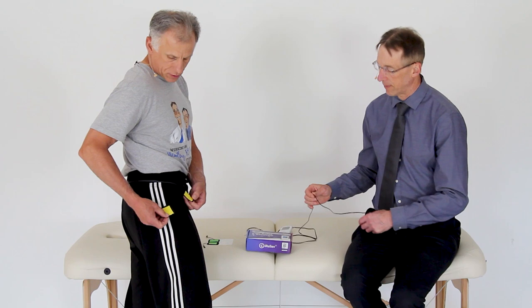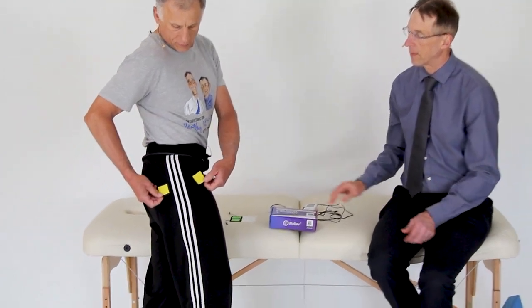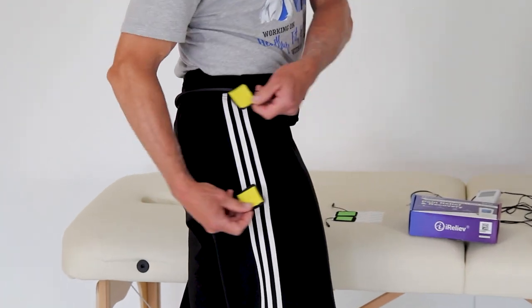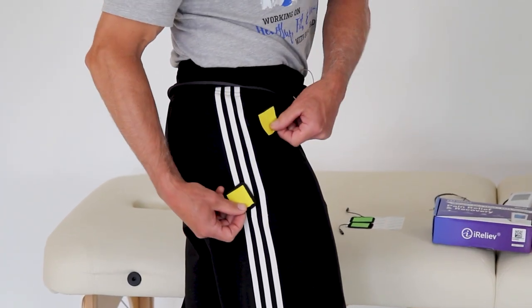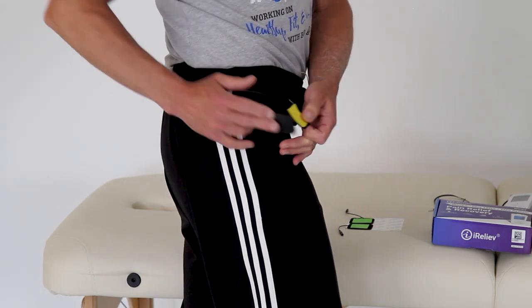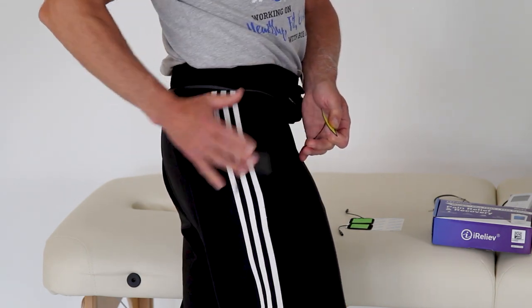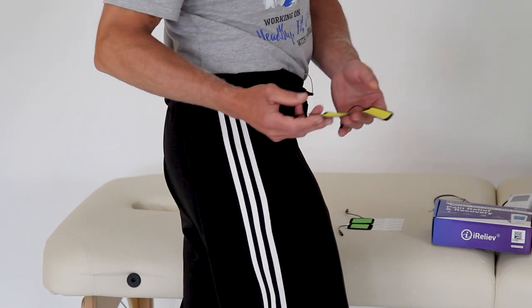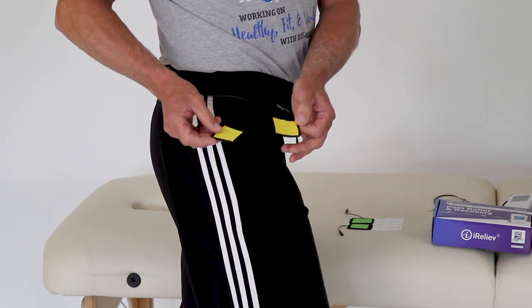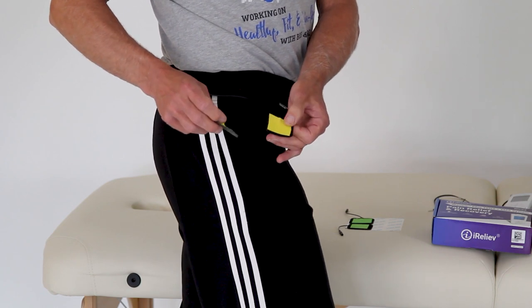The next option is to surround it with two pads. Let's say here's the painful area, one here, or I could go here and here. However you want to put it so that it surrounds it. If the pain is pretty global and it's a larger area on the hip, then you may want to use all four pads.